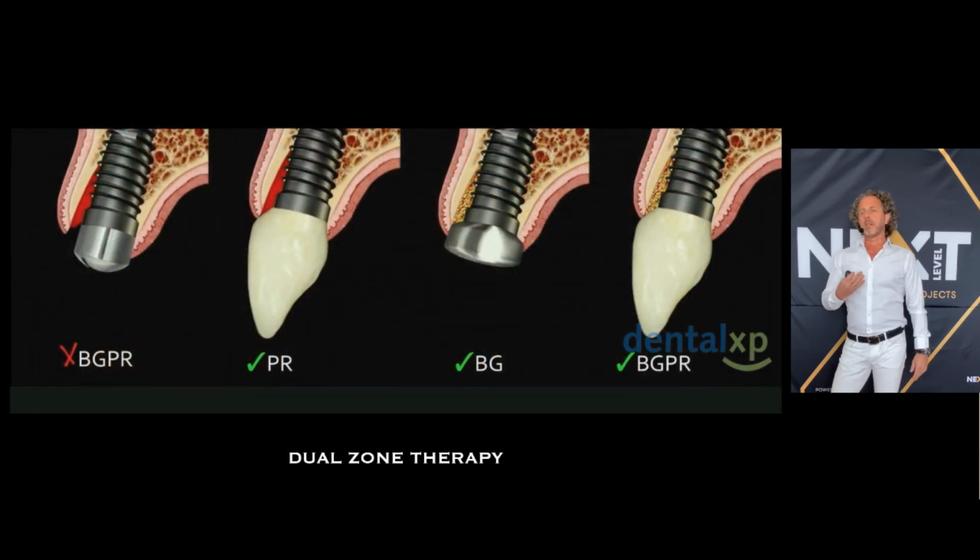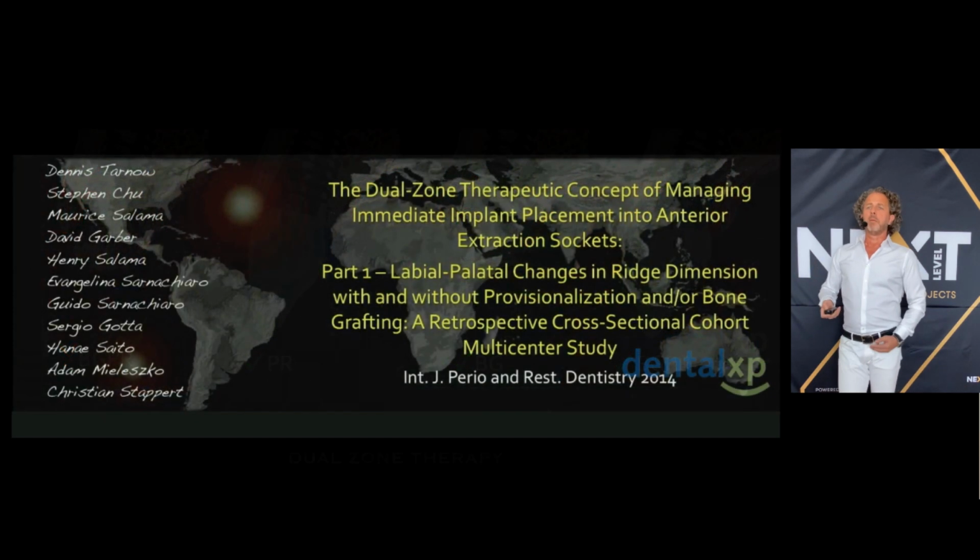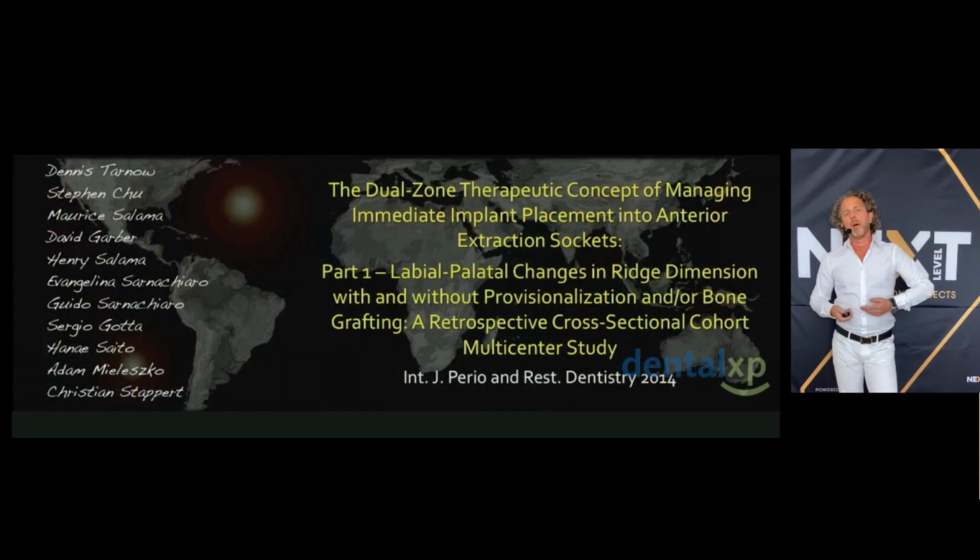So there's another concept which is a prosthetic one. It's called the dual zone therapy. It means whenever possible, place an implant, do some bone grafting and utilize an immediate temporary. We have to make a difference between immediate loading and immediate temporization. Now I'm speaking about immediate temporization.